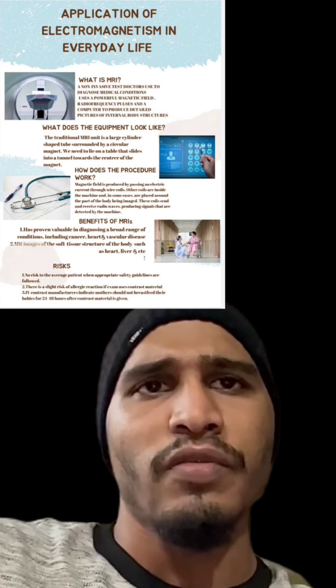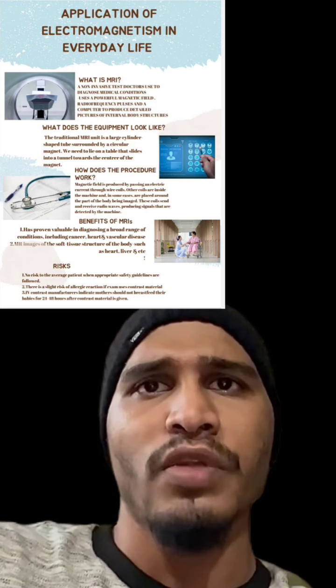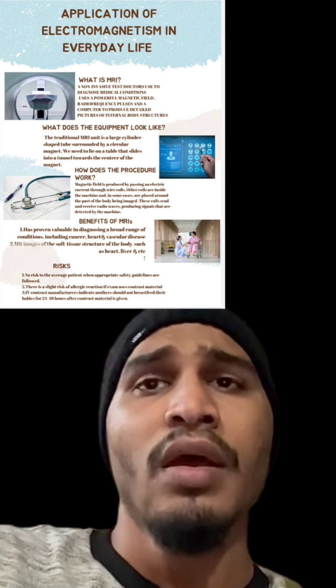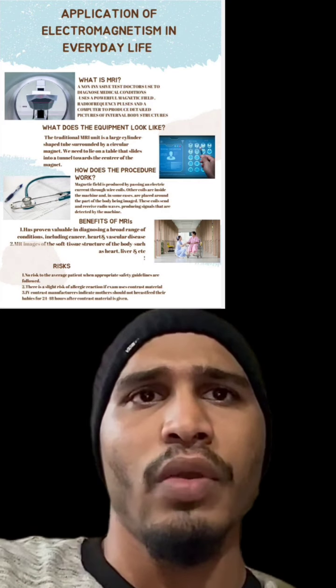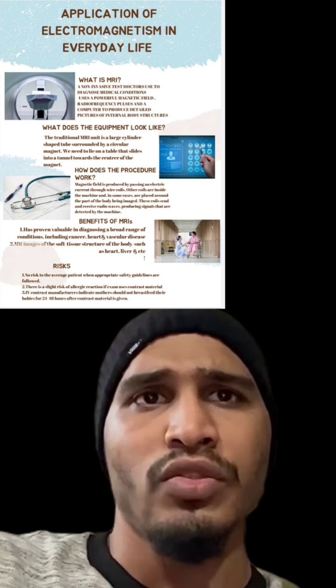What is MRI used for? MRI scanners are particularly well suited to image the non-bony parts or soft tissues of the body. They differ from computed tomography (CT) in that they do not use the damaging ionizing radiation of X-rays. The brain, spinal cord, and nerves, as well as muscles, ligaments, and tendons, are seen much more clearly with MRI than with regular X-rays and CT. For this reason, MRI is often used to image knee and shoulder injuries.